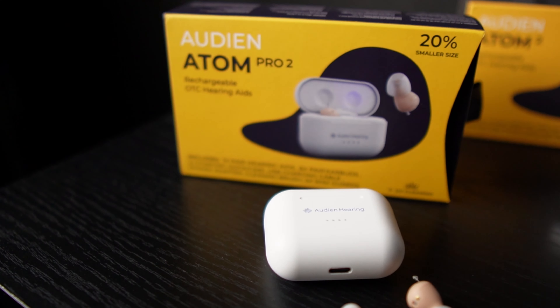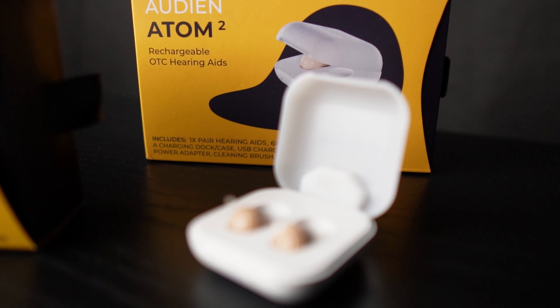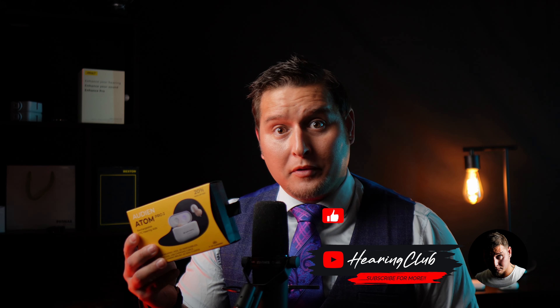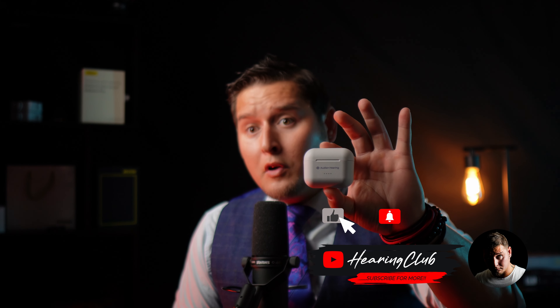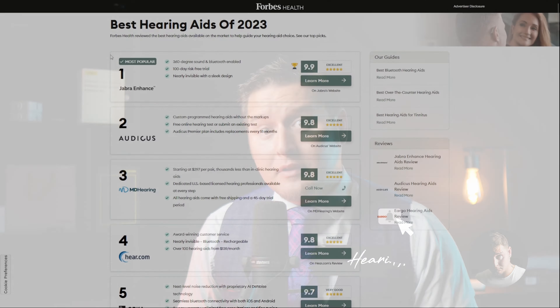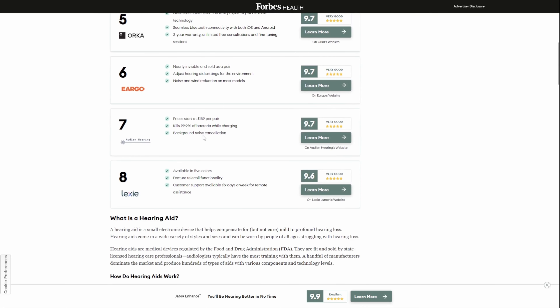Hey folks, welcome back to another Hearing Club video. My name is Brian and today we are going to be taking a look at two over-the-counter hearing aids by a company called Audien. We have the Atom 2 and the Atom Pro 2. This is a relatively new OTC hearing aid company that is featured on Forbes top hearing aids of 2023, ranked number seven, so they should definitely be on your radar.